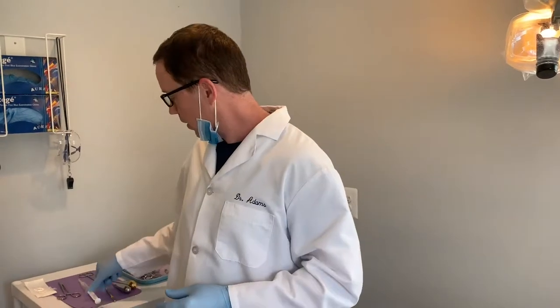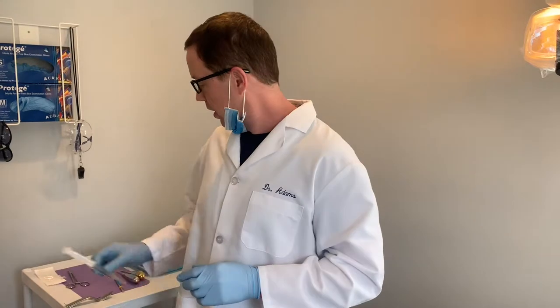We will take ozone and oxygen gas, which is in this tube here. Ozone is O3 and oxygen is O2. That being a gas, it is easily delivered down into the pores of the bone. It'll travel throughout the jawbone and kill any bacteria or fungus that have made their way down into the bone and promote healing. And then we have drawn two vials of the patient's blood that we're currently spinning in the centrifuge, and that is being processed for platelet-rich fibrin. You'll get to see how we put that into the extraction site.